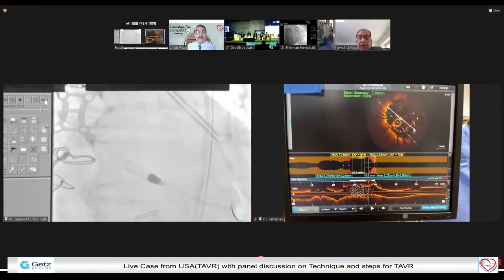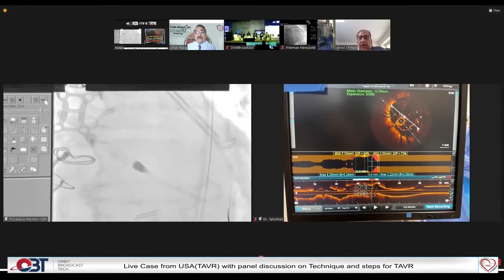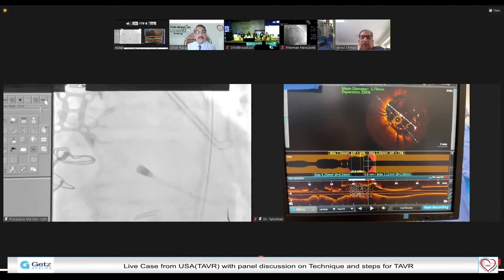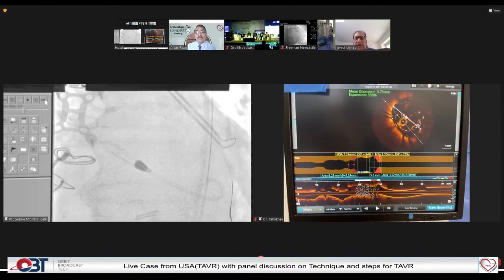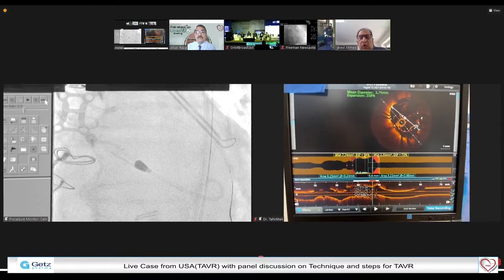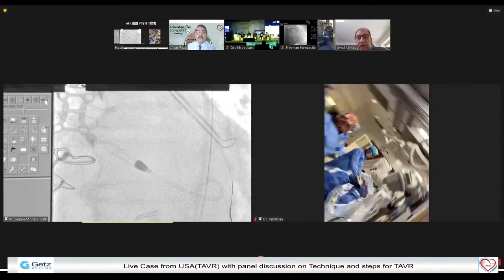We just reported our biggest experience, and that was purely imaging guided. I think the advantage of IVL in imaging, which I just touched on this morning, was that obviously you can appreciate the cracks after you have done the IVL. But in at least 30% of the cases, I found that rotatripsy, I call it, rather than rotashock, is necessary, to be honest with you. And this lesion could have been ideal for IVL as well, Tahir.